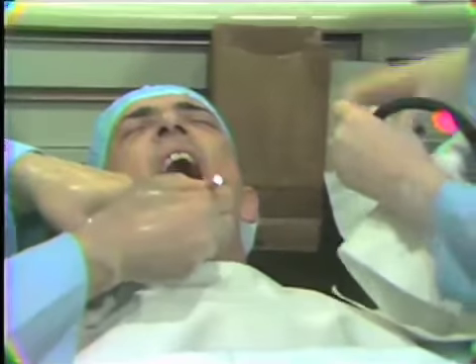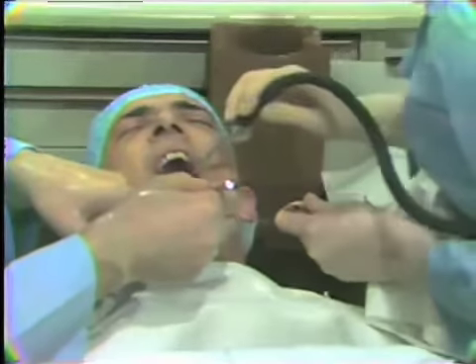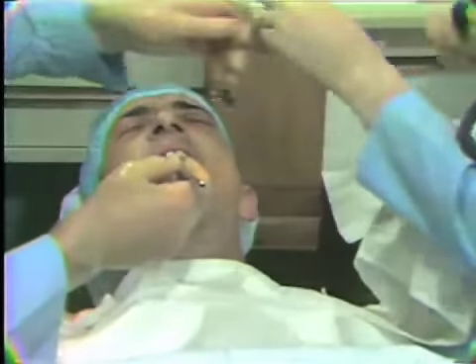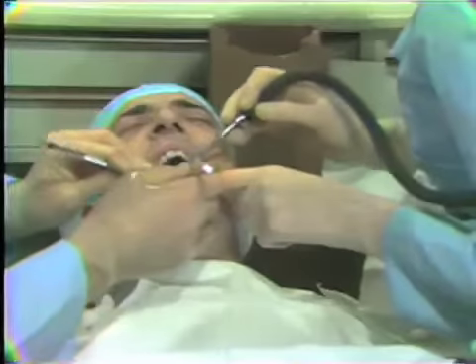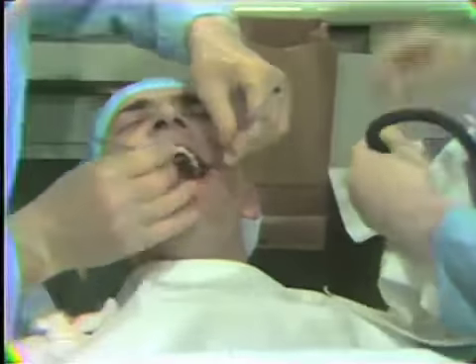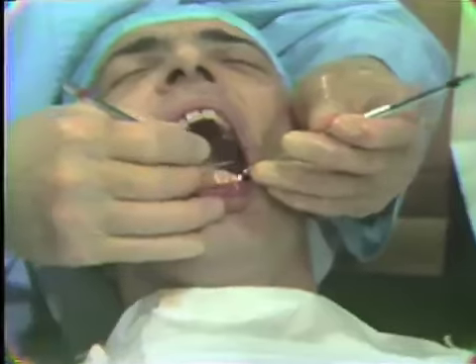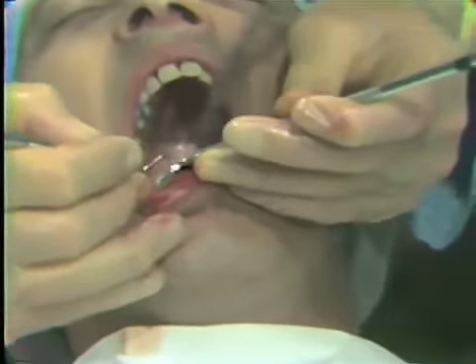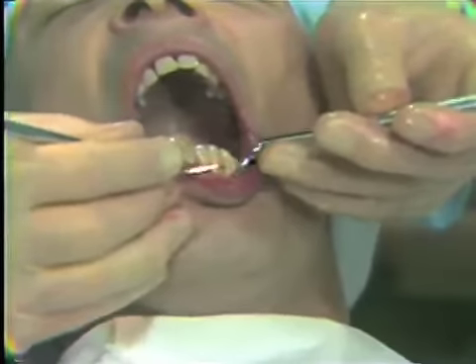During the course of the procedure, the instruments in the mirror will tend to pick up some of the bleeding, and again it is helpful for the assistant to take the instrument and clean it off with a saline sponge. Irrigate directly in the interproximal areas, please.